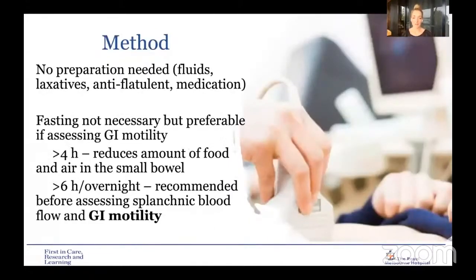So in terms of the method, the great thing about intestinal ultrasound is that no preparation is required. It's a brilliant point of care test, and that's what we do in our clinic. So when patients talk about any symptoms, we get them off to intestinal ultrasound, do it straight away, and get the answers that we require in terms of if there's active inflammation versus functional symptoms. So you don't need any bowel preparation, no laxative, any anti-flatulence or any other medications.